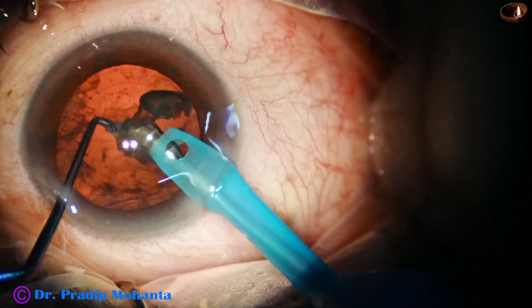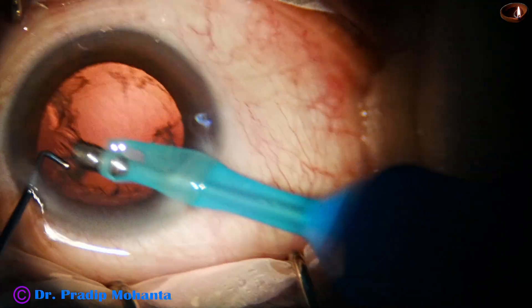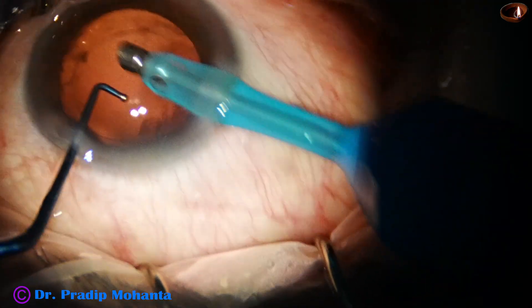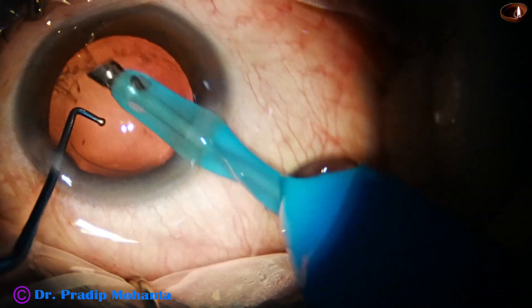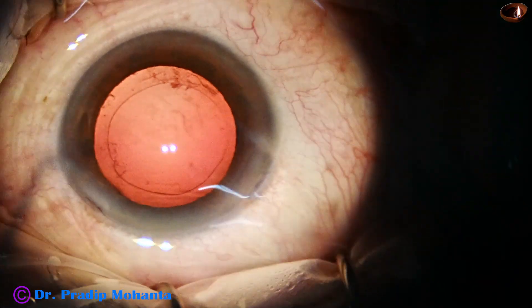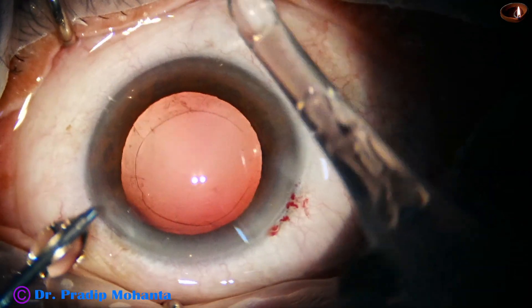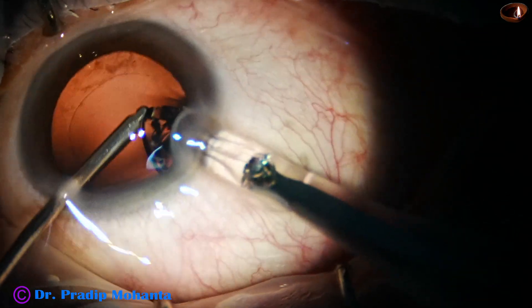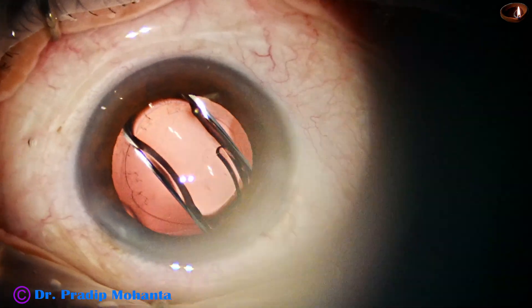The nucleus and epinucleus are managed. Cortex can also be cleaned by the handpiece itself, but this has a learning curve — there are separate options to remove the cortex. Now, hydroimplantation of a single-piece monofocal intraocular lens is done. This is Sensar from Johnson & Johnson. I have no financial interest in the equipment and materials used in this surgery.